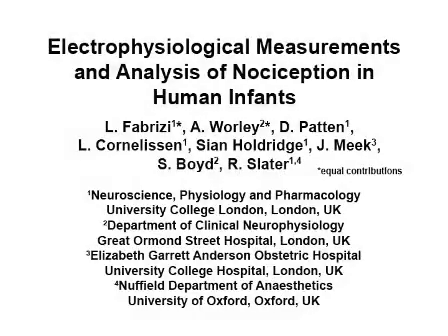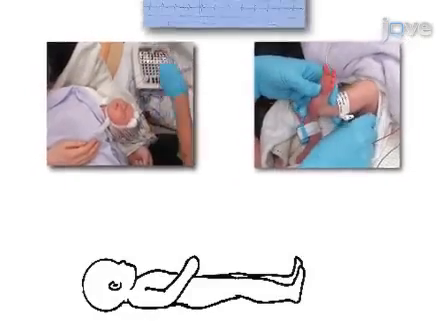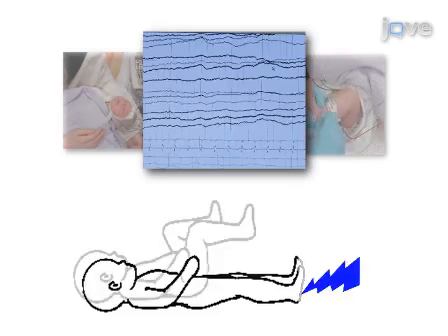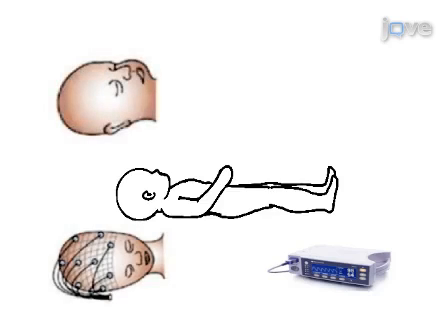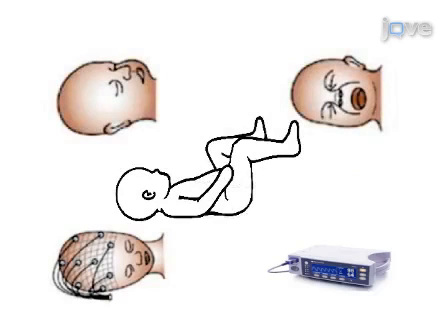The overall aim of the following experiment is to record and characterize human infant nociceptive specific brain and spinal cord activity. This is achieved using EEG and EMG techniques to measure electrophysiological activity in the central nervous system following clinically essential noxious procedures. The first step is to ensure that high-quality physiological recordings are obtained from infants when they experience experimental tactile and essential noxious stimuli.